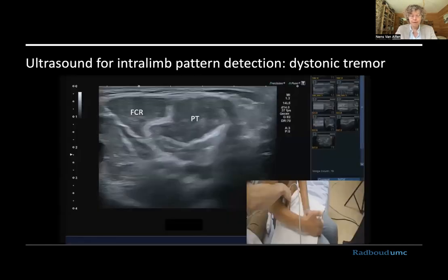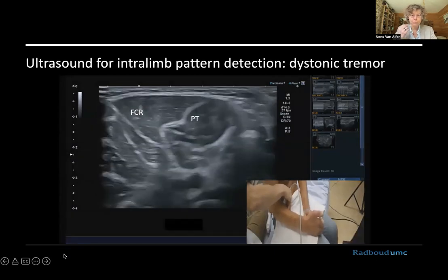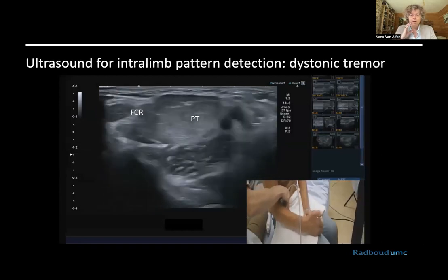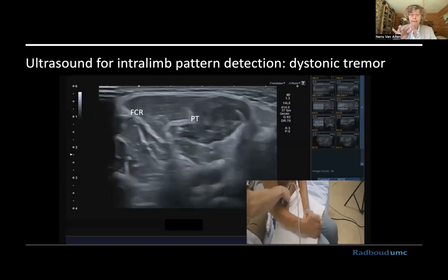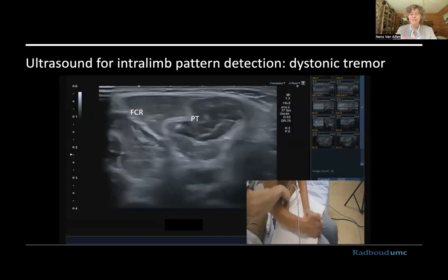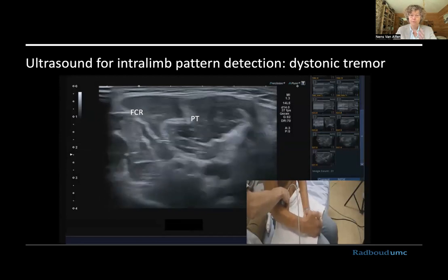So you could also look at the pattern in a limb. Here we're scanning the flexor region. FCR is flexor carpi radialis. Pronator teres is right next to it. They're sort of yin and yang, those muscles. And if I start the video, you can see the tremor, which is much more pronounced visually. And you can also quantify that in the pronator teres. So I think this might be one of the more practical uses at this point: if you want to inject this patient with botulinum toxin, I think you rather target the PT than the FCR, right? In this case, because it's probably more effective in reducing the tremor amplitude. And patients don't complain about frequency, they complain about the amplitude of the tremor. That's what's causing the symptoms and severity.